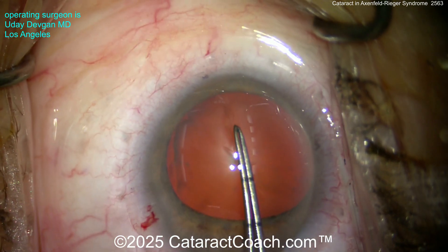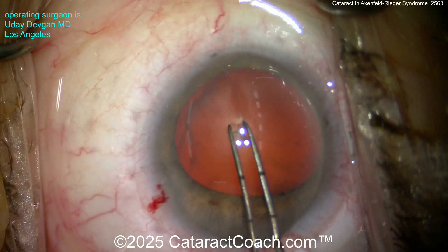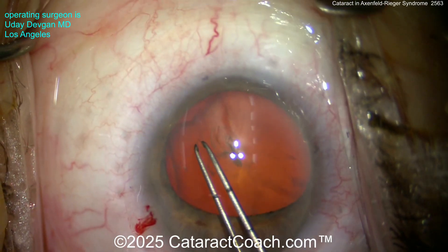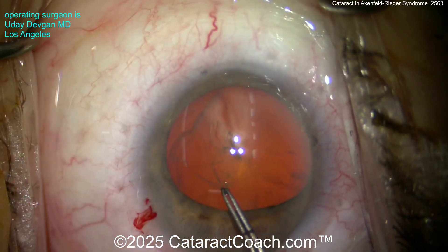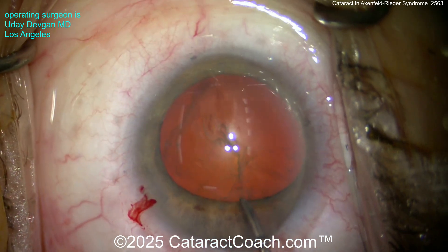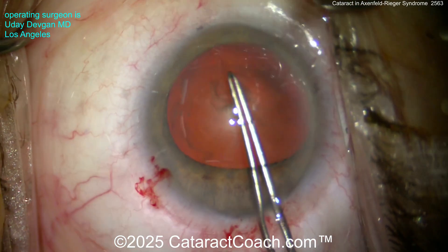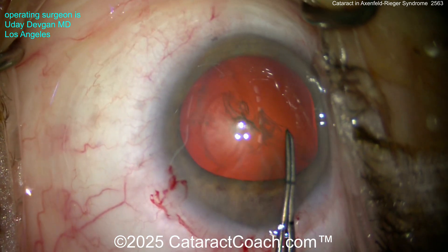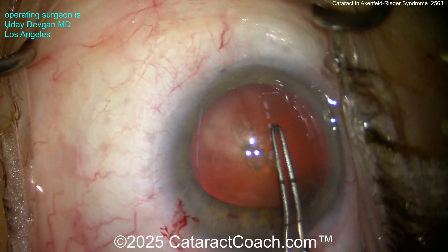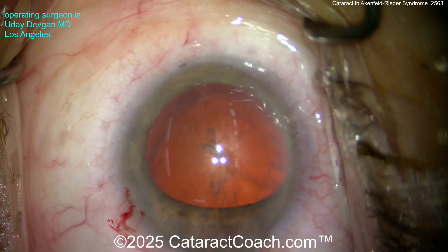Now starting the rhexis. It's important to get the rhexis lined up with the patient's visual axis — line up the rhexis with the crystalline lens, not with the dilation, which is asymmetric. My forceps are marked at two and a half and five millimeters from the tip. As I go temporally, I'll need to make this rhexis right up against the iris. I want this centered on where the light reflexes are — the Purkinje image. I want the IOL centered on that Purkinje image, which is also very close to the patient's visual axis. I don't want to use the pupil as a guide because it's such an asymmetric dilation.